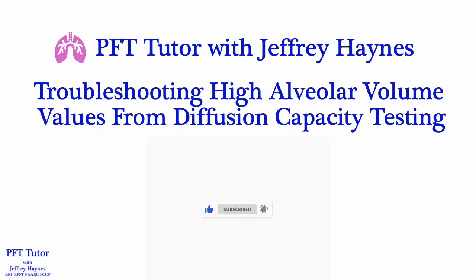In this video, we're going to discuss a troubleshooting event triggered by an alveolar volume value greater than the total lung capacity, which is physiologically impossible. Most of you probably do not use the DLCO system used in this case, but I hope you'll still find it useful for me to explain my mindset and approach to troubleshooting.